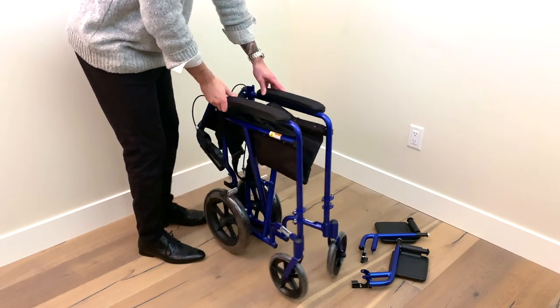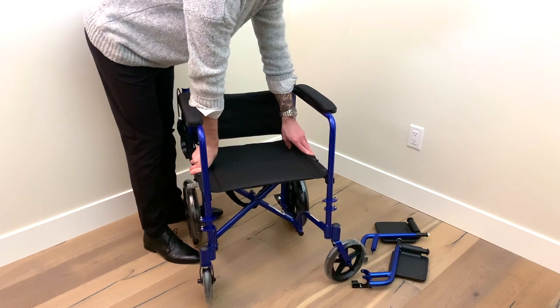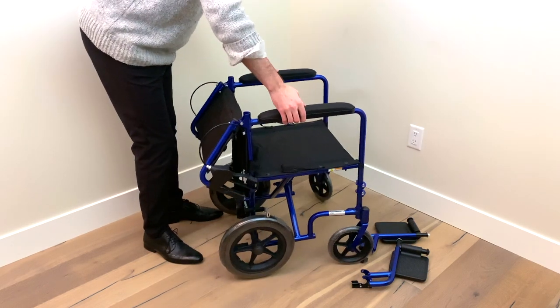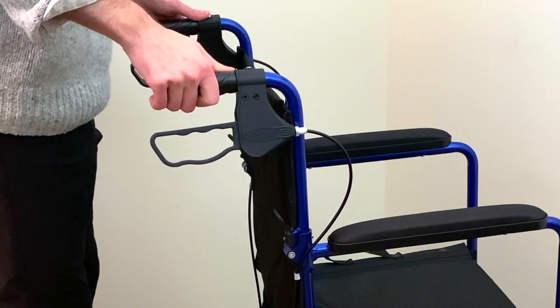First, unbox and inspect the pieces before you expand your transport chair. Next, open the chair and push down the seat rails. Then, lift the back support to the upright position until it locks into place.